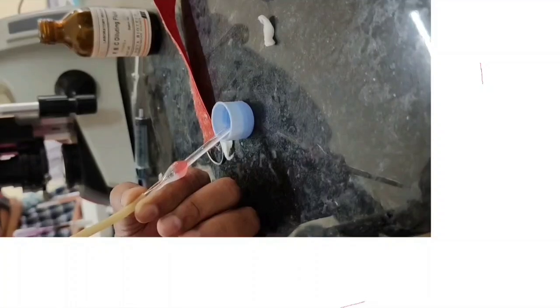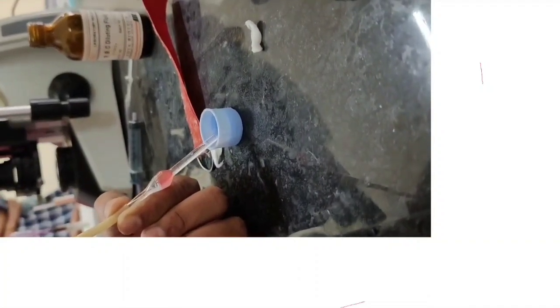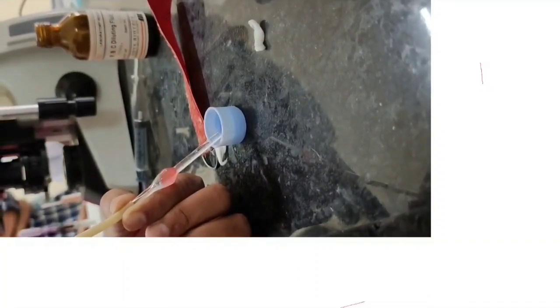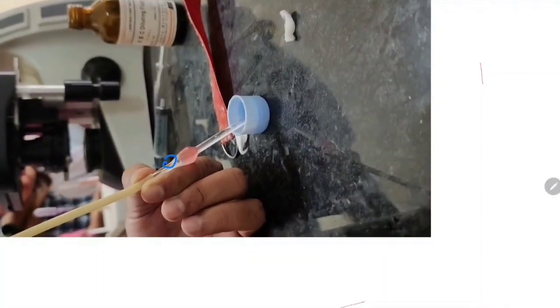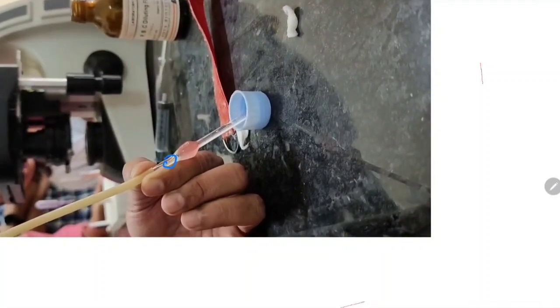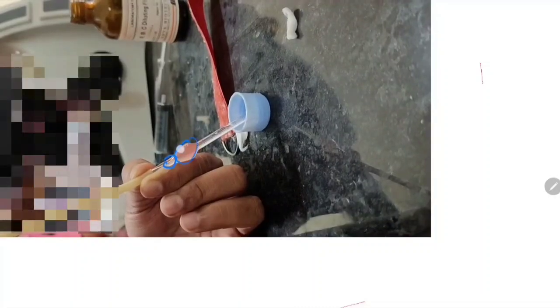Initially you can keep your pipette at 45 degrees and slowly, gradually you should put your pipette vertically, otherwise an air bubble will get trapped inside the pipette and this bulb area. So to avoid that, always draw exactly to the 101 mark. Okay, so be careful.